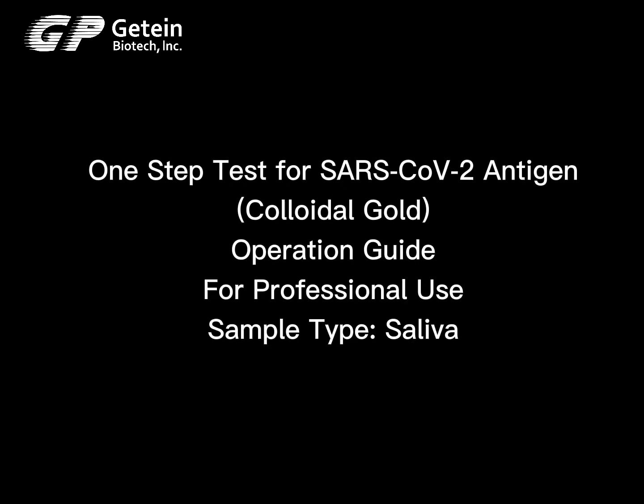One-Step Test for SARS-CoV-2 Antigen Colloidal Gold. Operation Guide for Professional Use. Sample type: saliva. Test kit contents are shown.